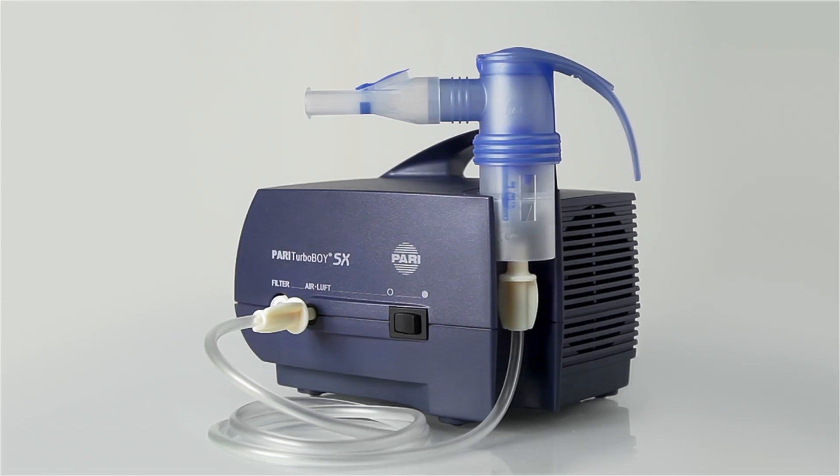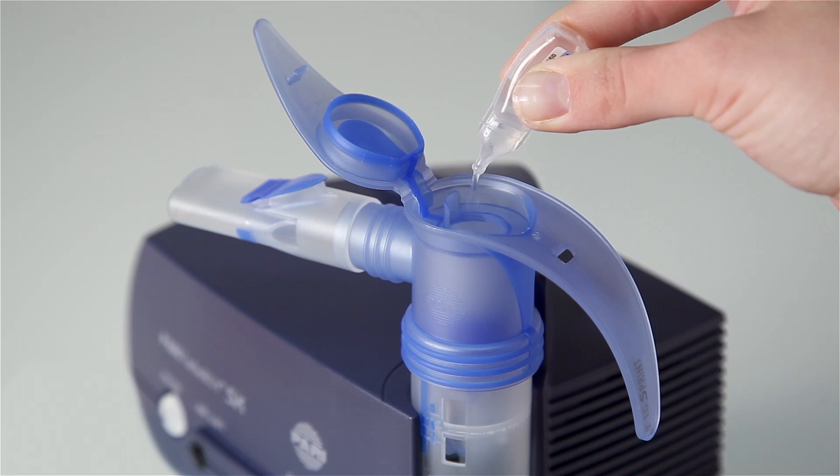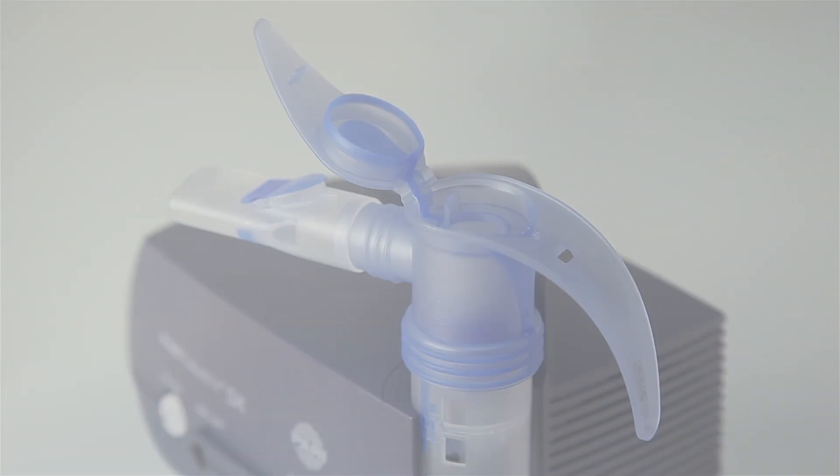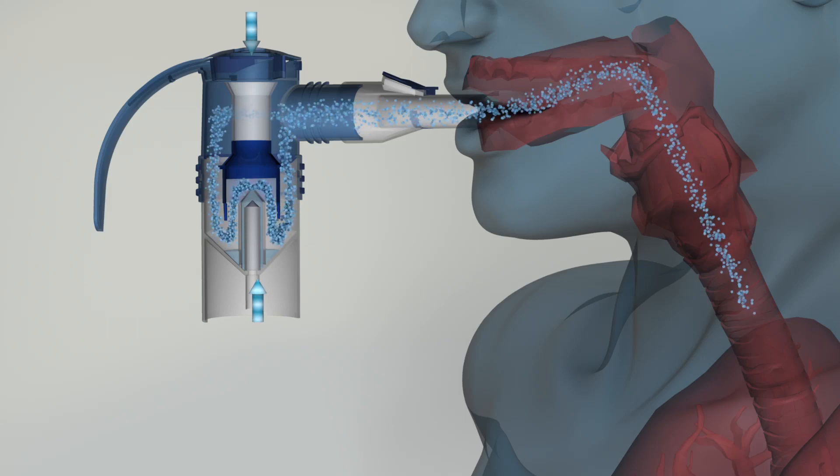Inhalation therapy is easy. Simply open the nebulizer lid and pour in the inhalation solution. Then sit upright and breathe in slowly and deeply.